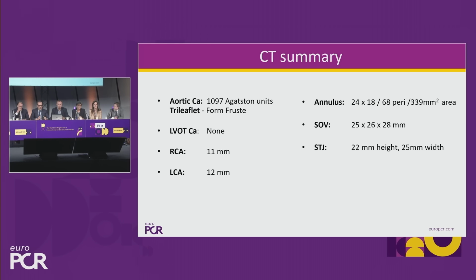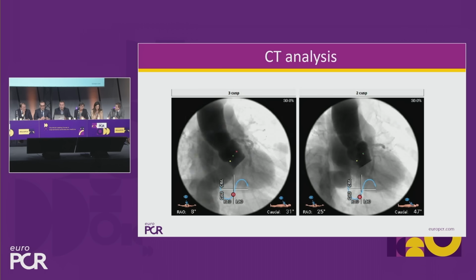So where you are when you are in gray zones between two sizes with a Navitor platform, what is your experience? Yeah, I think that's a very important question in clinical practice. So I mostly rely on perimeter-derived annulus diameter in patients treated with self-expanding valves. But it's not only about the annulus, it's also about maybe a degree of calcification.